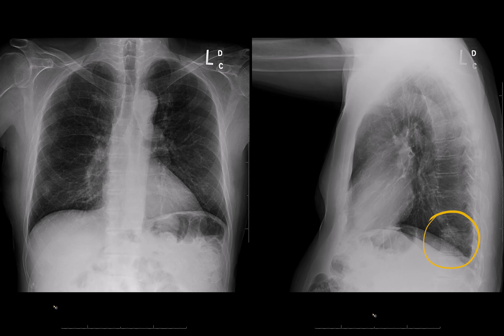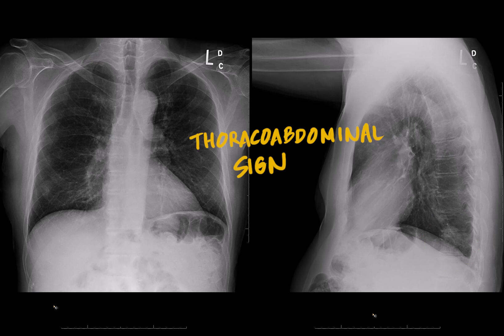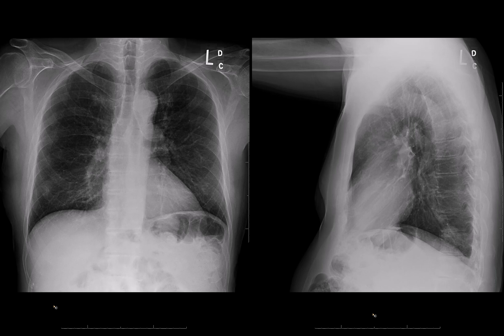There are two radiographic signs I want to go over for this case. One is called the thoraco-abdominal sign. This was coined by Ben Felson decades ago. Basically it says that if you have an abnormality that you can see through the diaphragm, it's in the posterior chest, typically the lower lobe. The reason for that is the diaphragm slopes down going from anterior to posterior, so there's a lot of lung behind the apex of the diaphragm.